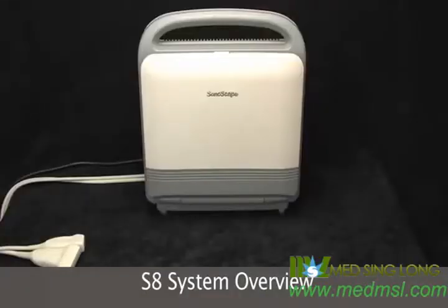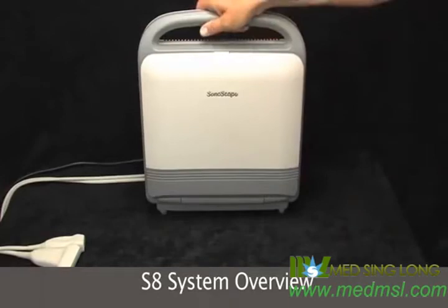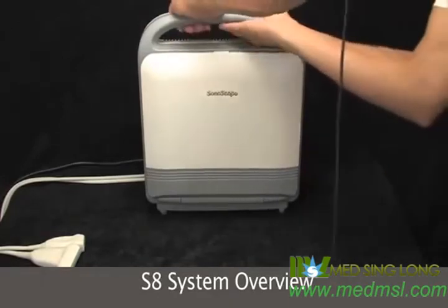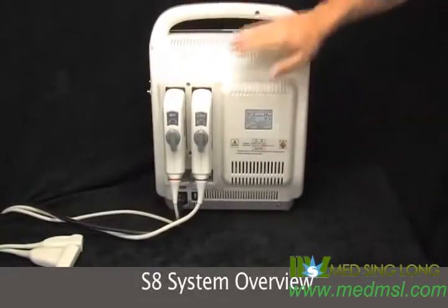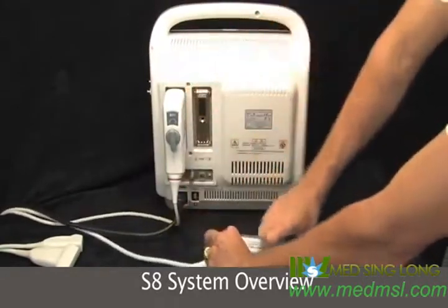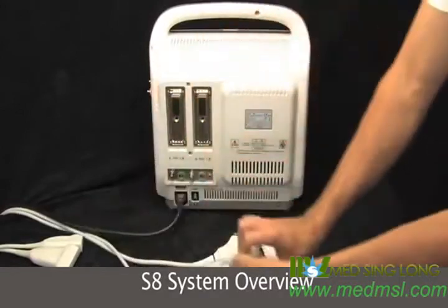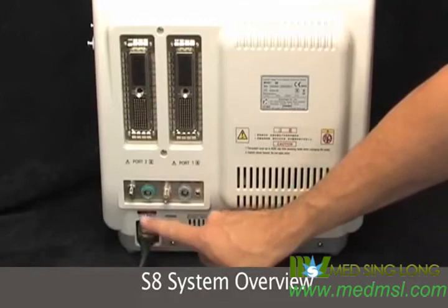This is the Sonoscape S8 ultrasound machine. As you can see, it's very small and it has a tiltable flat screen on the front, a big handle up top, two transducer ports, main power, and this is where the power cord goes in.